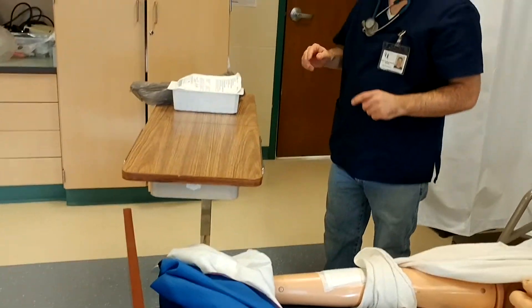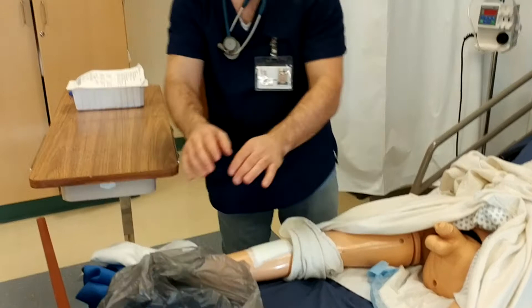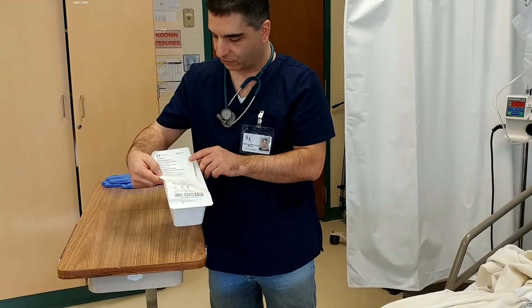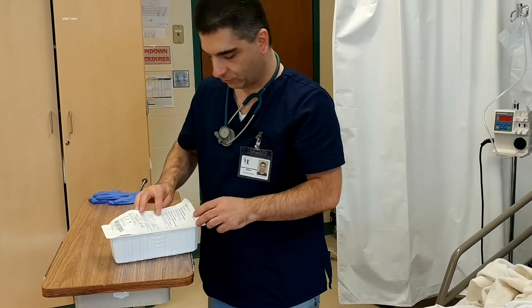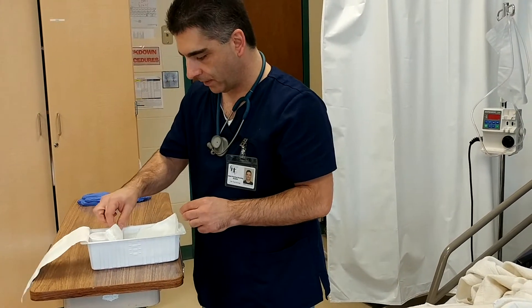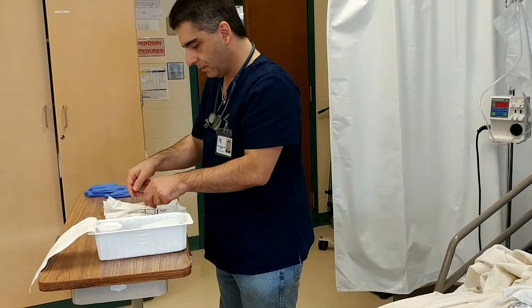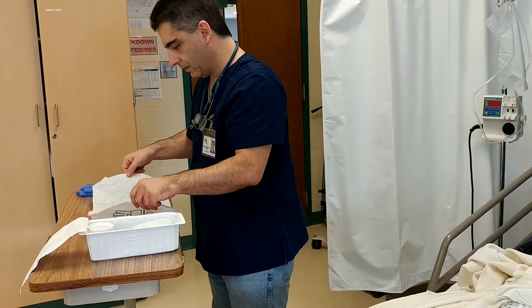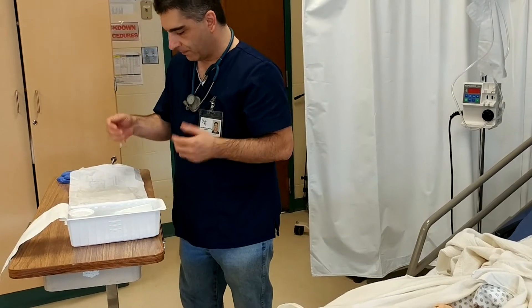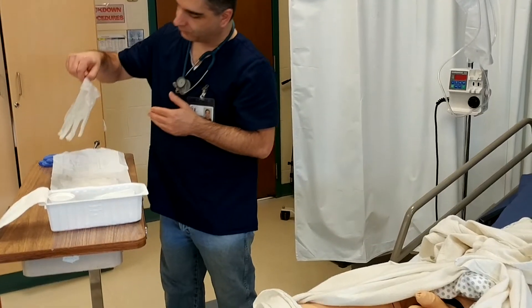Now I have my trash bag — I'm going to set it over here. And I have my 14 French catheter, a straight catheter for men. I'm going to pull back my label and pull out my sterile gloves. I'm going to open them up. I'm going to prop it up a little so it doesn't fall back down on me. Now I'm going to pull out my left glove first, grabbing it by the cuff.